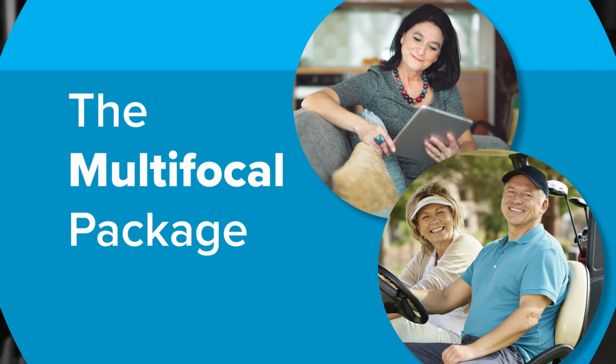If you haven't had monovision before, it's important that we simulate it for you prior to surgery with a contact lens trial, just to make sure that you would be comfortable with it.